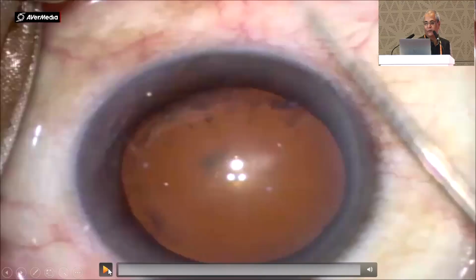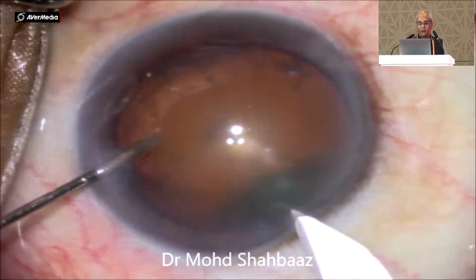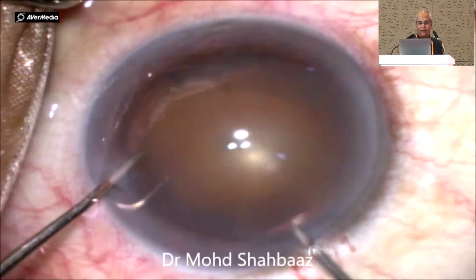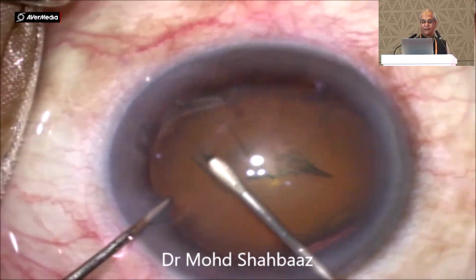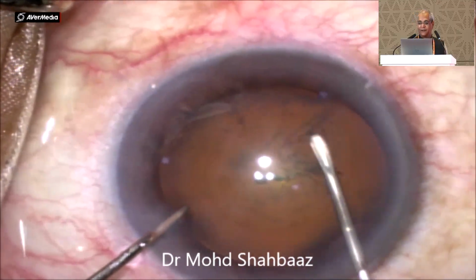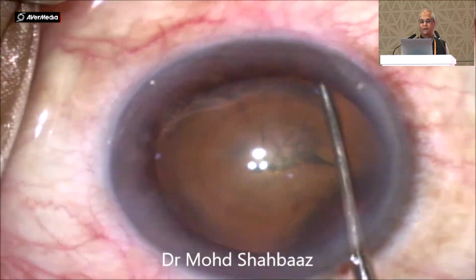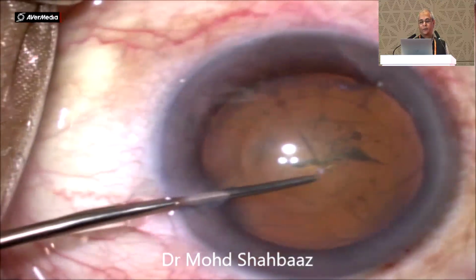This is a small video, just to show the centration of the lens. I, being a cornea surgeon, don't want to make too many ports, so I make only one port for the entry. And I don't do cortical aspiration. So I will remove everything in one go. So what is behind this? What I will do is I will separate the anterior capsule. This is one additional step, but it's very simple, just one sweep.